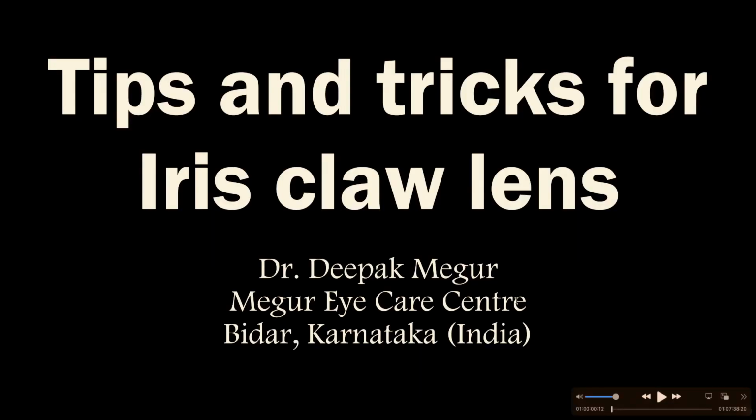We have seen already the glued eye, we have seen the CT lens, and now we are going to see the iris fixated lens. He has made this iris fixated lens so simplified that we can go and start doing surgery at our center. The CT flex lens, what Dr. Navin has shown you, is available in the market, without any financial interest. Epsilon is marketing it. Without any interest, but we are showing something, you should know where to purchase these things. So it is with Epsilon, this needle.